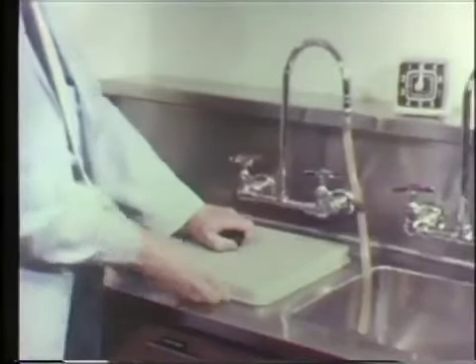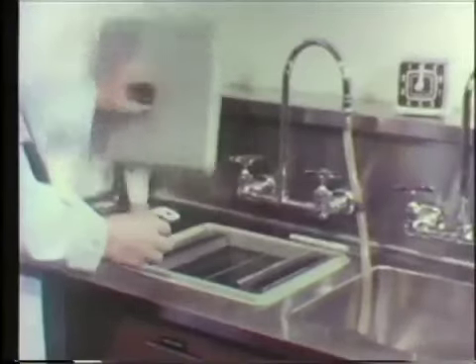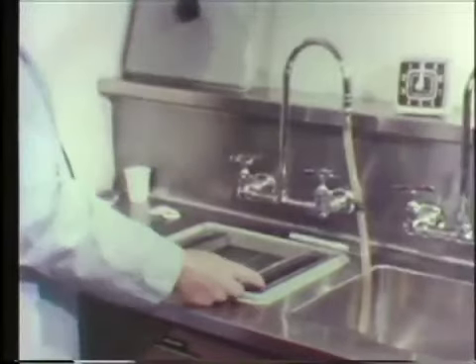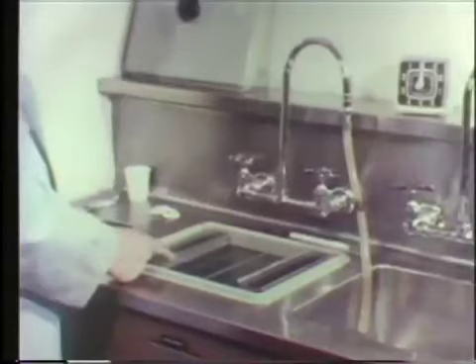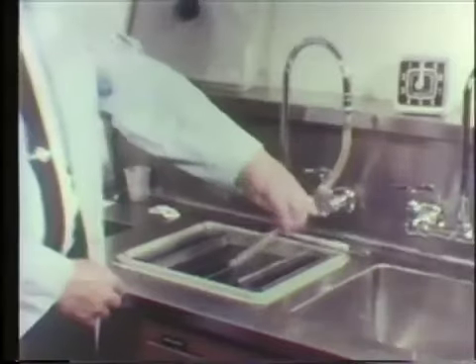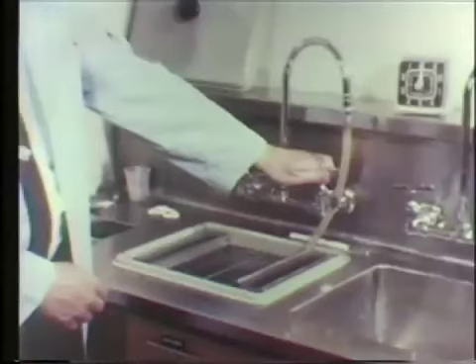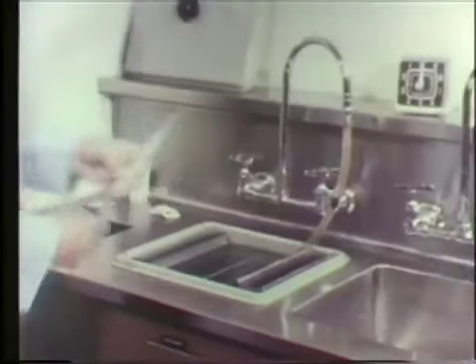Now we take the top off of the X-ray tanks, place the top safely aside. Here we have a gallon of developer in the right-hand tank. Then in the center is water, and the left-hand tank contains fixer. Now we wish to have running water, so we turn on the water flowing through the plastic hose.